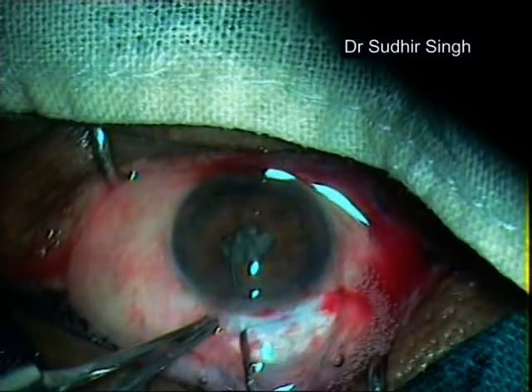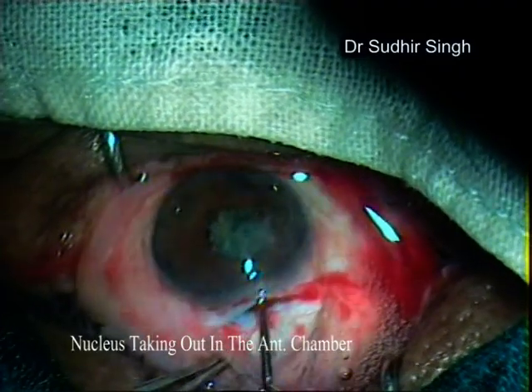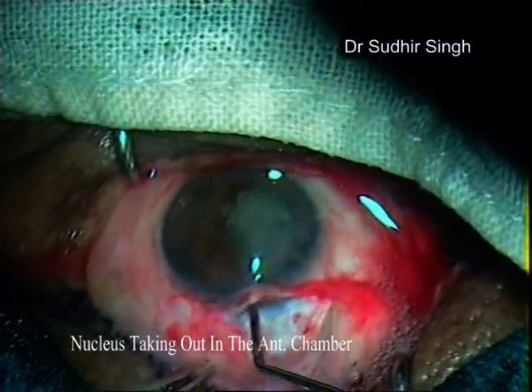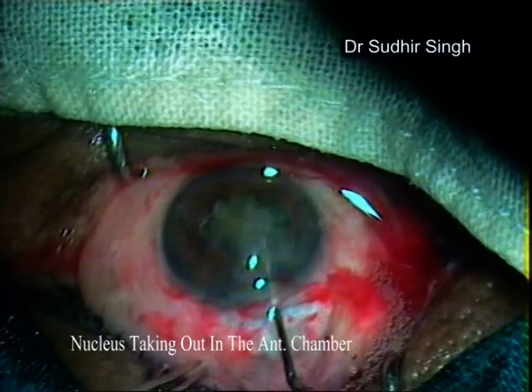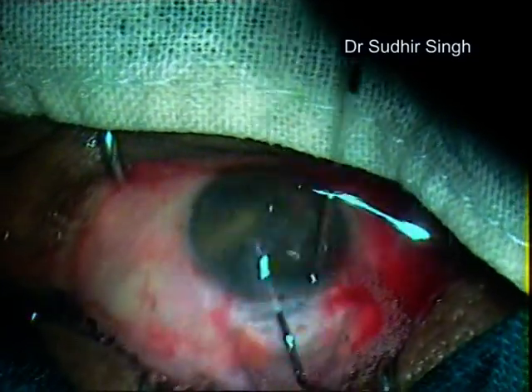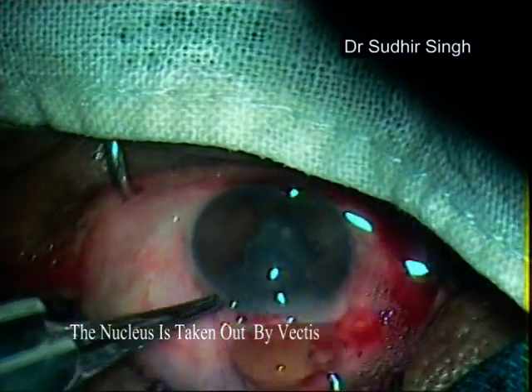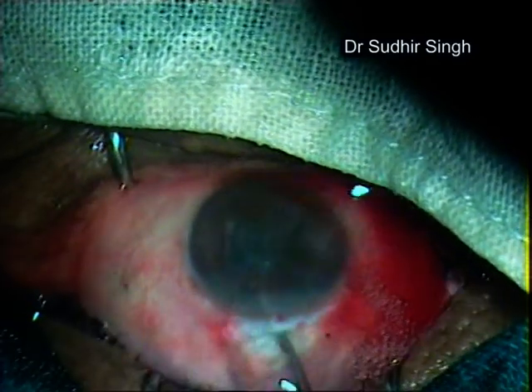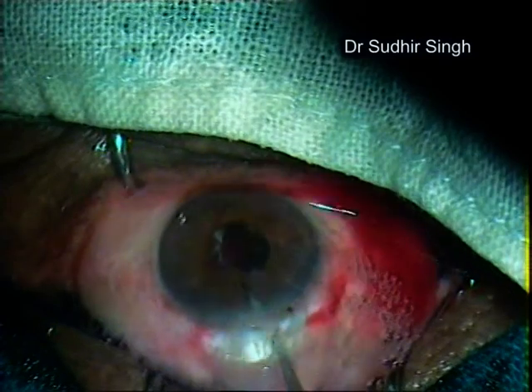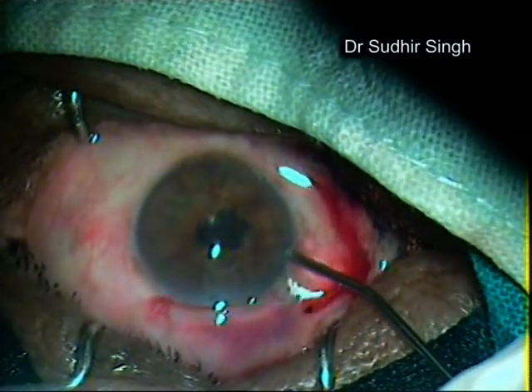After hydrodissection, the nucleus is rotated and taken out into the anterior chamber by Sinskey hook. The lens nucleus is taken out by vectis. The cortical matter is flushed out by injecting a fluid jet into the anterior chamber along with depressing the posterior lip of the tunnel simultaneously by irrigating cannula. A six millimeters PMMA IOL is implanted.